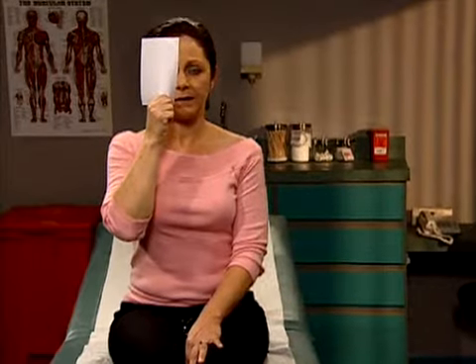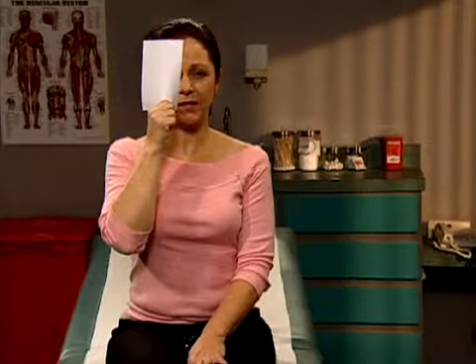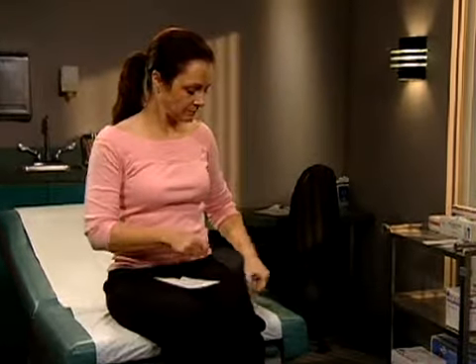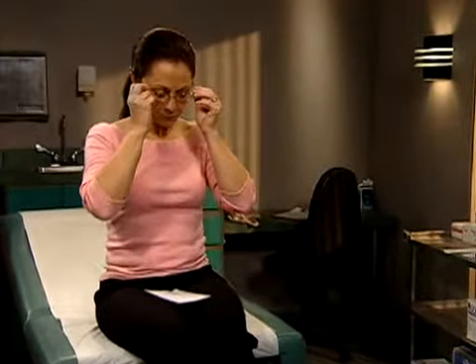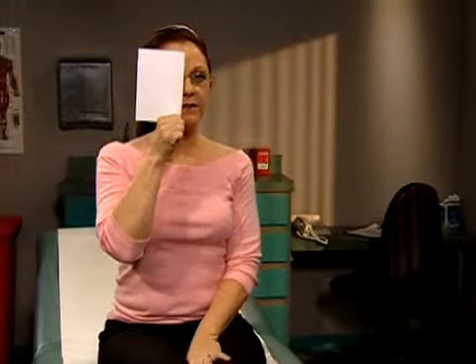P-E-C-F-D. Can you read anything on line 6? Maybe, but the letters aren't clear. Okay, now cover your left eye with the card and tell me which line you can read clearly. Line 5 again. Can you read that line backwards? D-F-C-E-P. Now we'll do this again. Put your glasses on and cover your right eye with the card. That would be line 8.